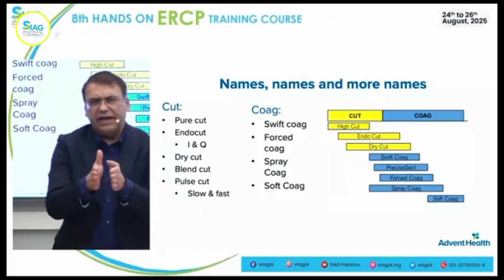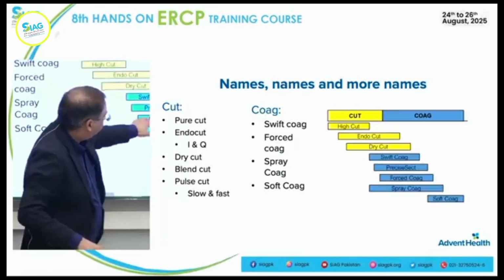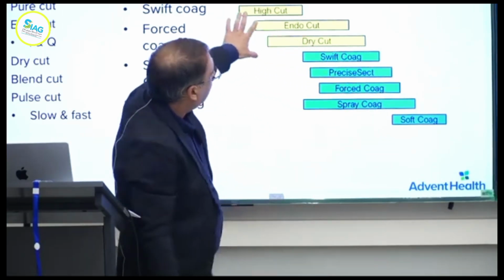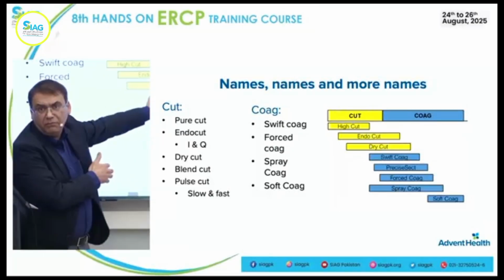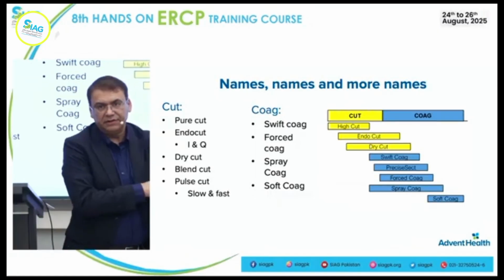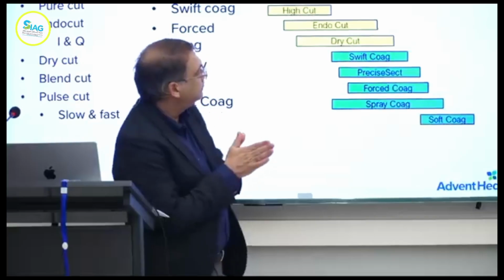So the color of the paddle, mostly when you are on this side, you're using this blue paddle, okay? When there is more cut part you want to use, you go with the yellow. Yellow for yellow, blue for blue. Okay.